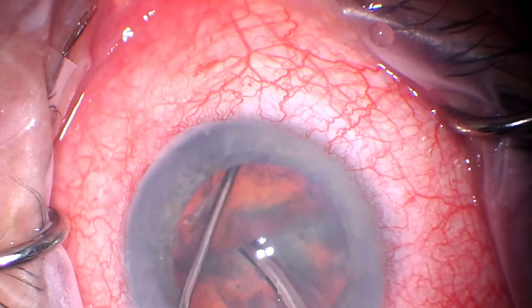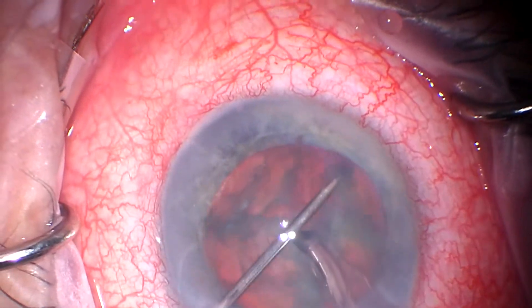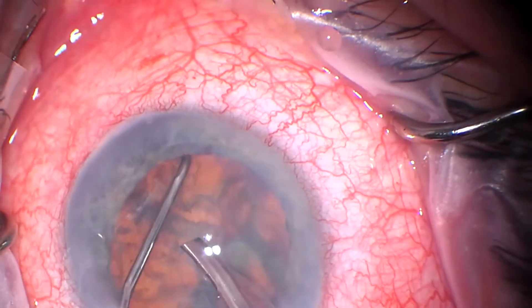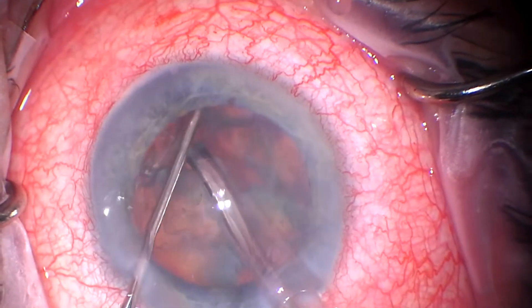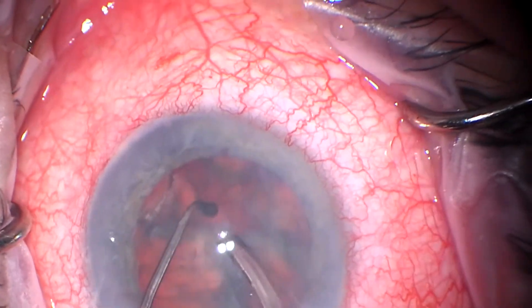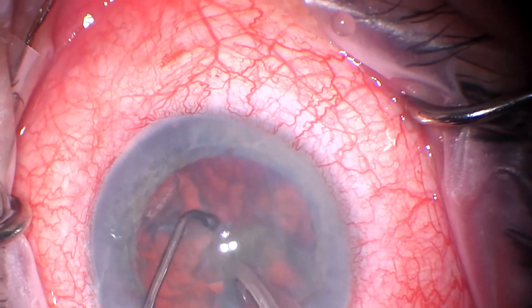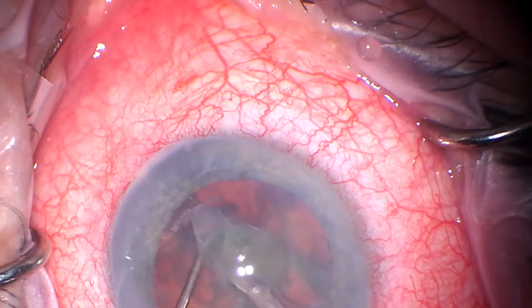I also find that when I do it this way I'm much less likely to need an additional tube of viscoelastic. But I do really like Hydrus. I would say it's my favorite MIGS procedure when done in the appropriate patient.